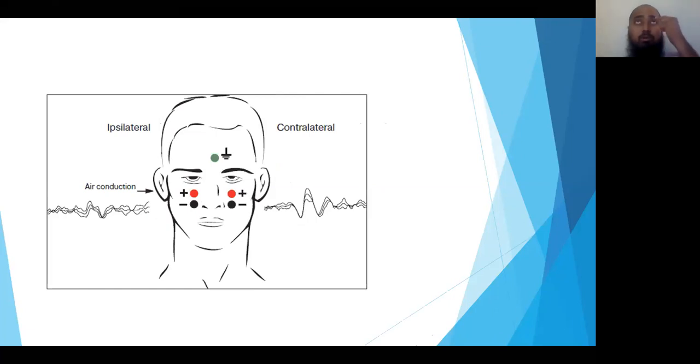This superior rectus is going to contract, and your inferior oblique is going to get relaxed. So the muscle will come outside. When you look at this orbit, when you keep touching, you have a bony ridge here. So you're going to check the patient's bony ridge like this. Don't poke into the eye, just check like this. And then once you have checked like this, you're going to keep your positive electrode very close to the ridge. So when we look up, the muscle will come outside.